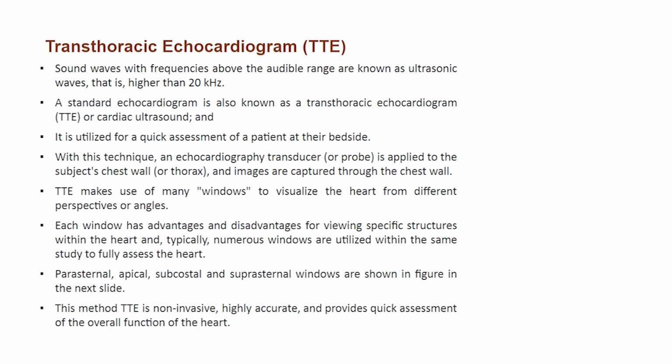Now, I am going to explain transthoracic echocardiogram, that is TTE. Sound waves with frequencies above the audible range are known as ultrasonic waves, that is higher than 20 kilohertz. A standard echocardiogram is also known as a transthoracic echocardiogram or cardiac ultrasound, and it is utilized for a quick assessment of a patient at their bedside. This method TTE is non-invasive, highly accurate, and provides quick assessment of the overall function of the heart.